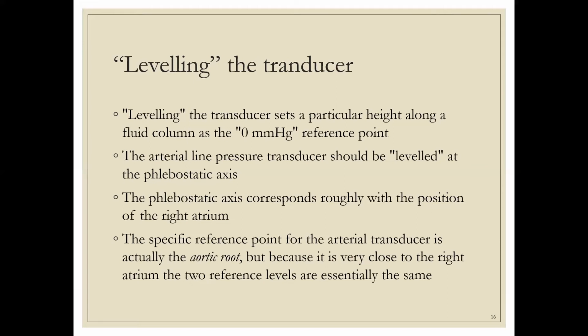Now we have to understand that because the pressure is measured at the transducer level, if the position of the patient changes, we have to adjust it. If the patient is lying supine, we have kept it at a particular level. But suppose the patient is standing, the phlebostatic axis will go high, and so we have to change the transducer level. Otherwise, the reading will be falsely high or falsely low depending upon how the position of the patient is changing.